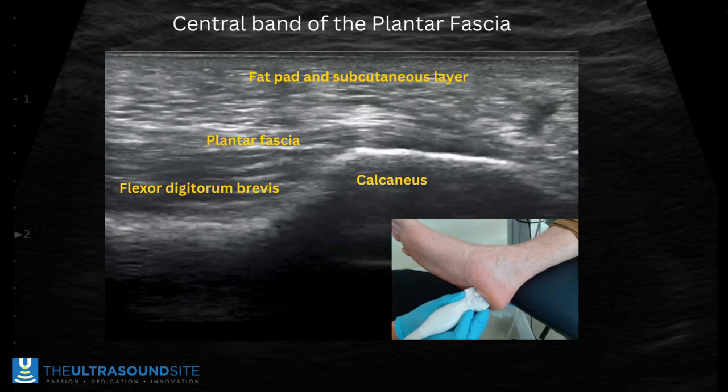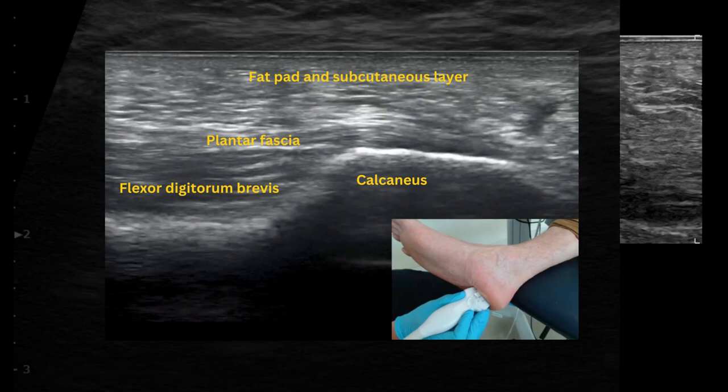This is what we're going to see on ultrasound. The calcaneus is that bright white bony landmark. The plantar fascia comes through to attach onto it in this long axis view. The flexor digitorum brevis sits deep to the plantar fascia, and then the fat pad and subcutaneous layers sit superficially above these structures.